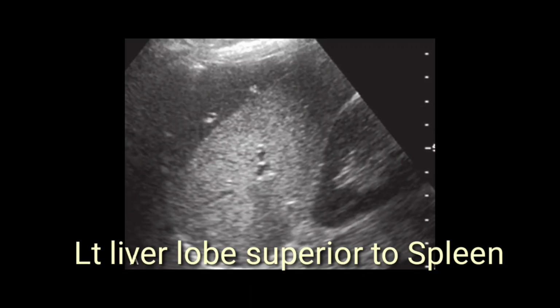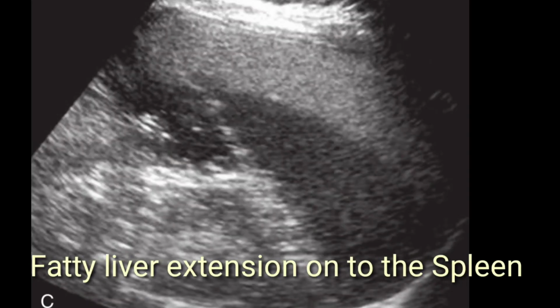This is another image. The spleen is clearly visible, but again the hypoechoic left lobe of the liver can be seen on the superior aspect of the spleen. In view, the left kidney can also be seen. In few cases the liver might not be enlarged, but you will still appreciate the left lobe, or sometimes angulation of the probe will project the left lobe of the liver into view. Quite often this can be seen when the liver gets enlarged. Here is an example of an enlarged fatty liver. You can see the echogenic left lobe of the liver resting on the superior border of the spleen. The spleen looks hypoechoic, which is due to the contrast effect.